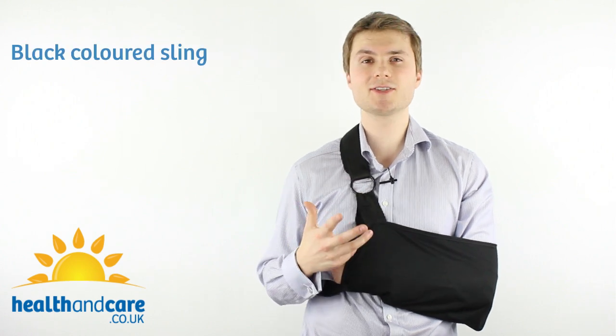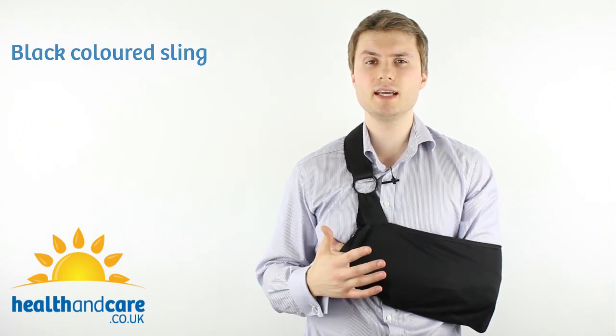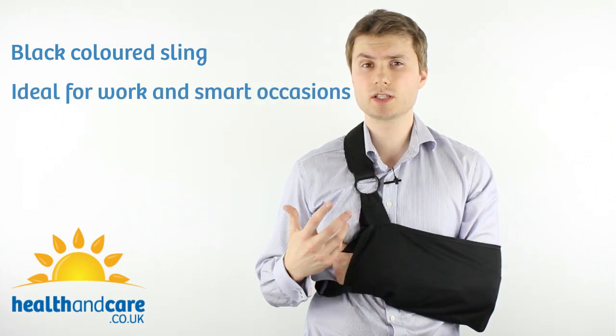Let's talk about the main features of the ProCare Clinical Shoulder Immobiliser. As you can see, the sling is black. This may sound silly, but it's incredibly difficult to find a black sling anywhere, which makes the ProCare Clinical Shoulder Immobiliser ideal for work and also for smart occasions.